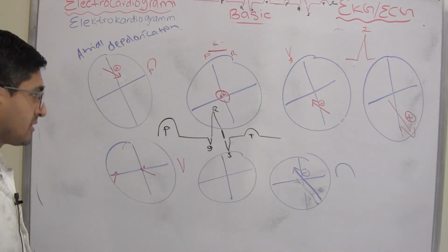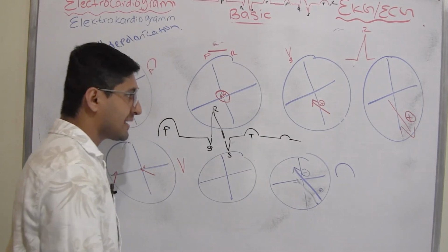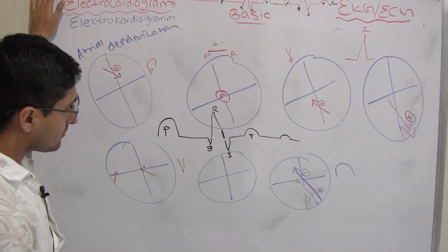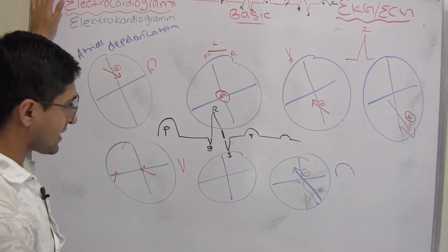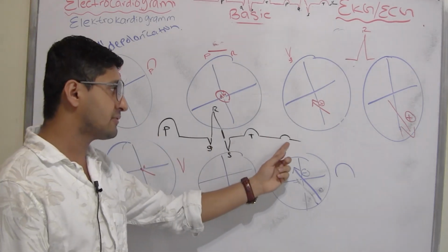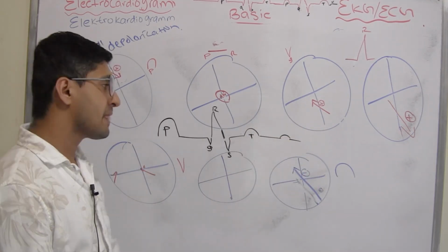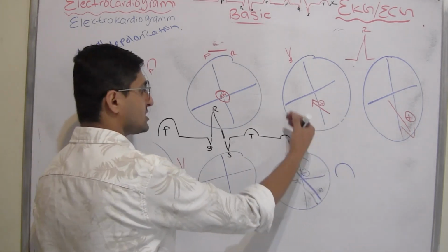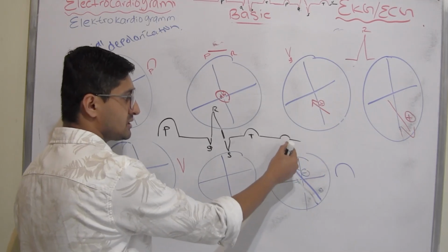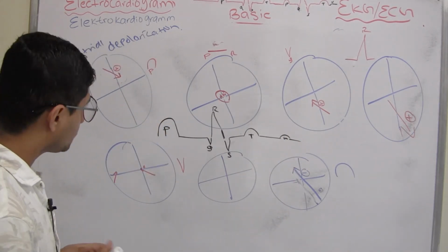Sometimes, let me quickly talk about this, you get to see later something called the U wave. There's not an exact answer for why this U wave is created, but there are multiple things I have read. One is that this U wave may be caused by the interventricular subendocardial repolarizations, which could give you this sort of U wave. The other is that when the ventricles are repolarizing, the papillary muscles vibrate and go through repolarization, and because of that you see this little wave that's called the U wave too. Okay, but that's what I have got to know so far.